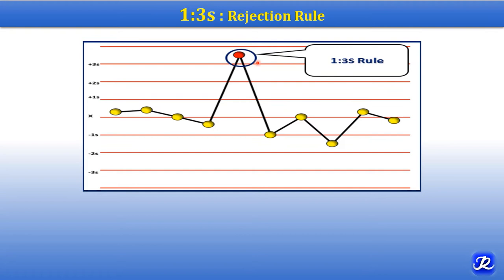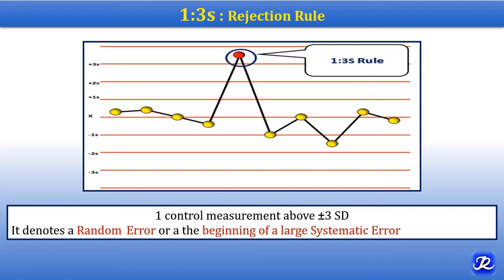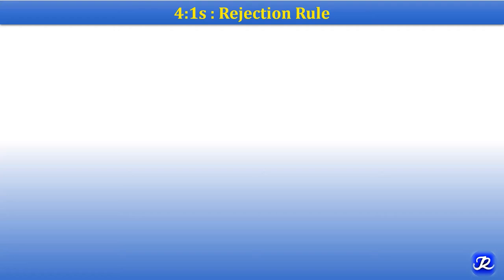In the 1-3S rule, one control measurement exceeds three standard deviations. This indicates random error or the beginning of a large systematic error. The 1-3S rule is a rejection rule.